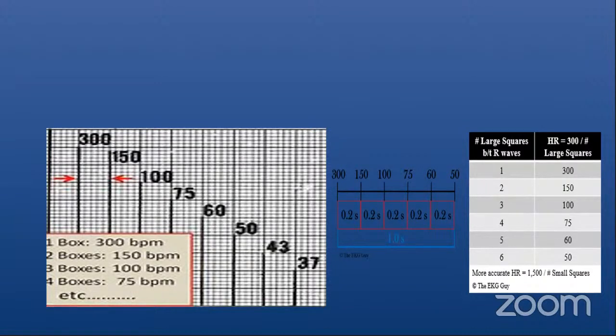Does that answer the question or not? Yes, I understand, but the problem is this, that they recommend that you put the real time ECG, not the 12 lead, but just the limb leads. Just the limb leads. You really need to have a look at the rhythm. And also they are saying that the pulse oximeter is not that efficient in assessing the rate of a baby who is sick enough. The ECG has much higher efficacy in calculating. That is true.